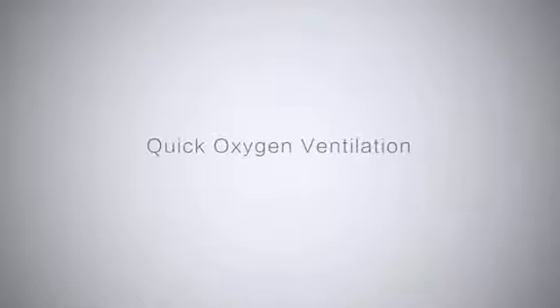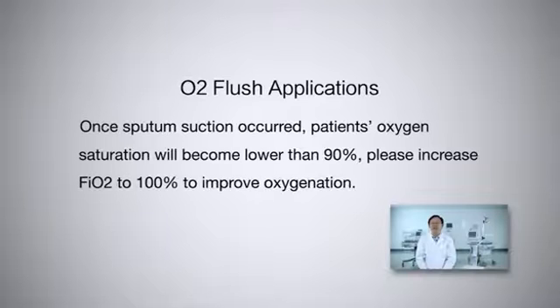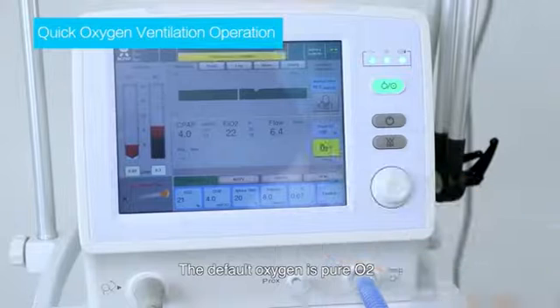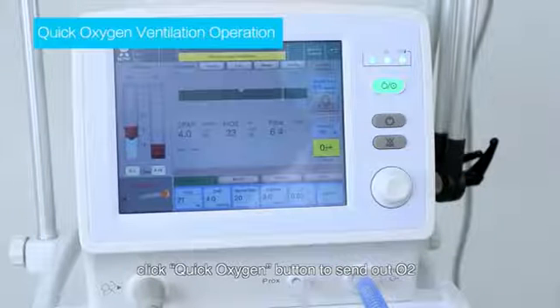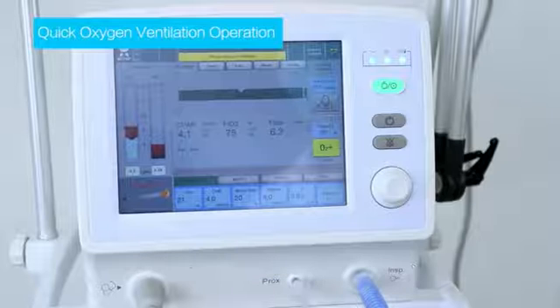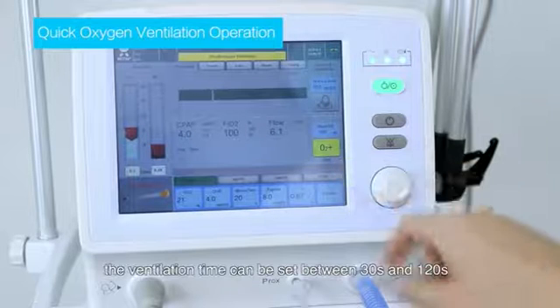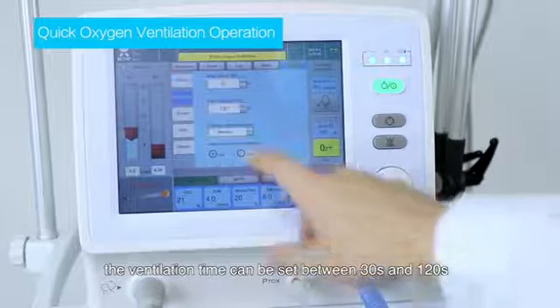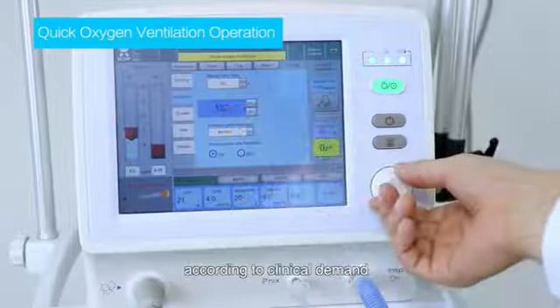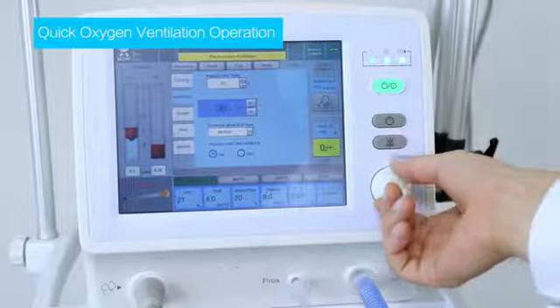Quick oxygen ventilation. The default oxygen is pure oxygen. Click Quick Oxygen button to send out oxygen. The ventilation time can be set between 30 seconds and 120 seconds according to clinical demand.